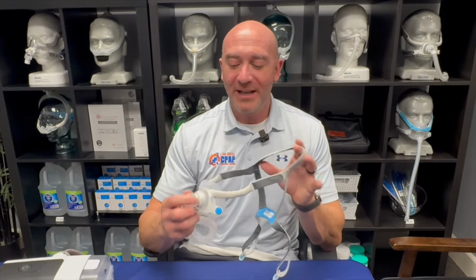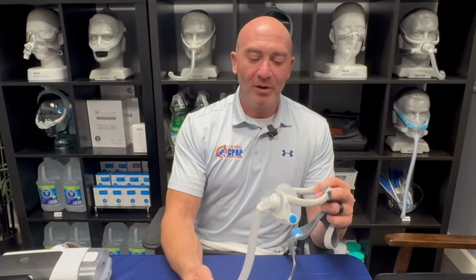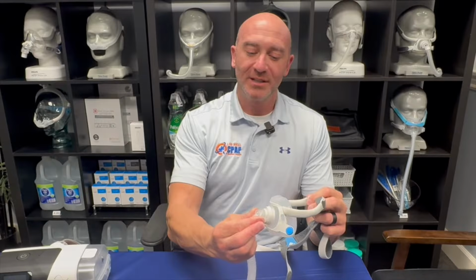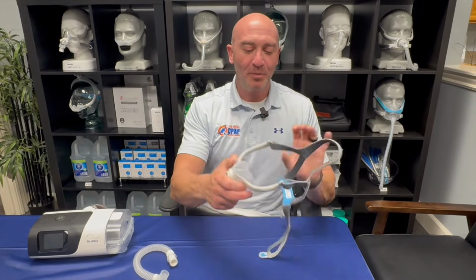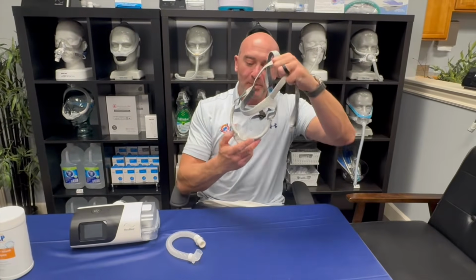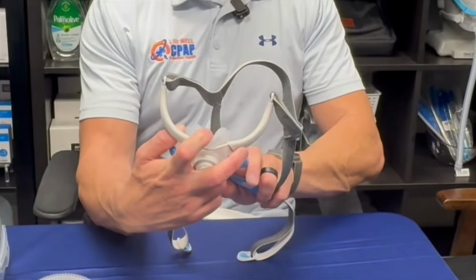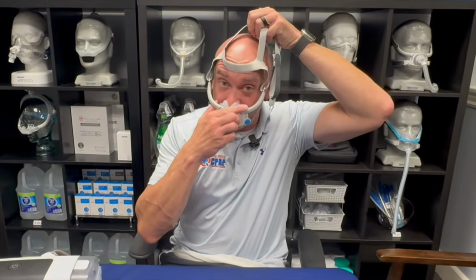But I'm going to go over fitting and adjustments of the ResMed F40. So one of the things you can do to make it easier to put on and off is you just squeeze here. This is going to pull off, and you can leave that aside, leave it in the tube. And then I always grab back here as I'm putting it on. I always tell people on these under the nose full faces where it's just bumping up against your nose to put your nose on it like a shelf. Don't dig your nose in.